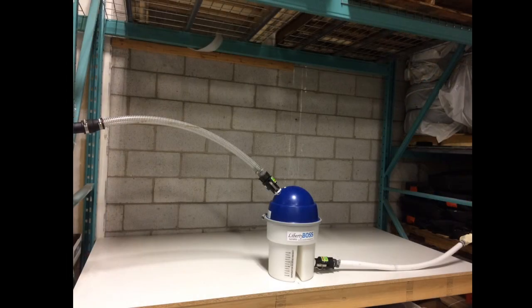Turn on your suction and feel every new joint for suction loss. If there is suction loss, re-tighten the fitting and test again. If there is no suction loss, you have now completed your Mars Liberty Boss amalgam separator upgrade. Welcome to the Mars family of environmentally friendly dental practices.